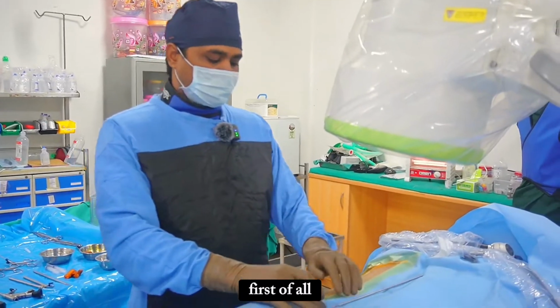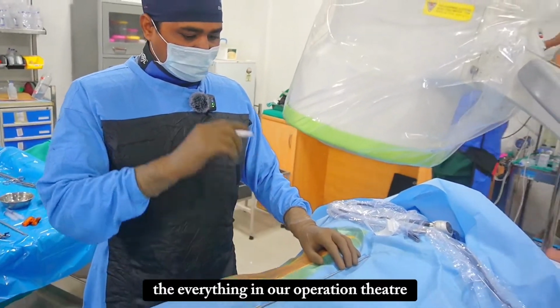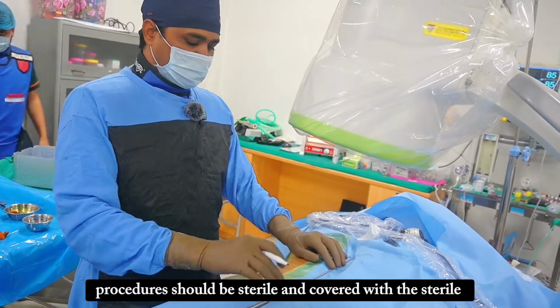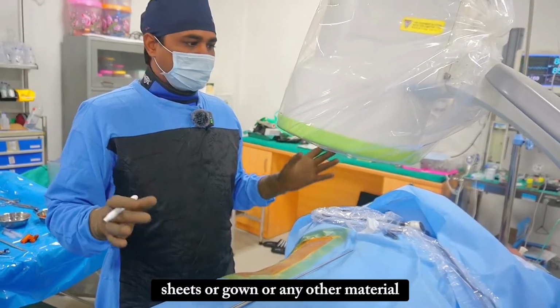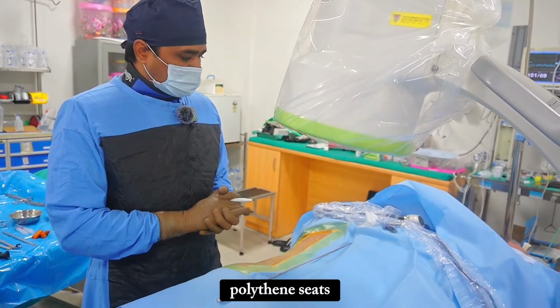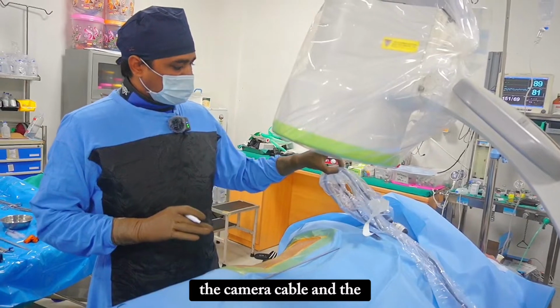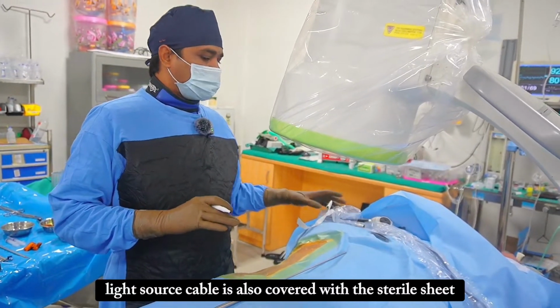First of all, the most important thing is that everything in our operation theater that comes in between our operation procedure should be sterile and covered with sterile sheets, gown or other material. This is the C-arm covered with a sterile polythene sheet, and the patient is fully covered after the spine scrub. The camera cable and the light source cable are also covered with a sterile sheet.